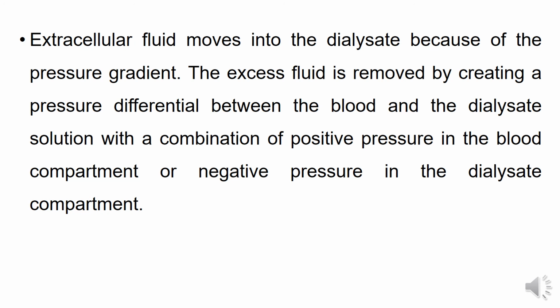Through this, the excess fluid is removed by creating a pressure difference between the blood and the dialysis solution. With a combination of positive pressure in the blood compartment and negative pressure in the dialysate compartment, through this pressure difference the fluid moves.